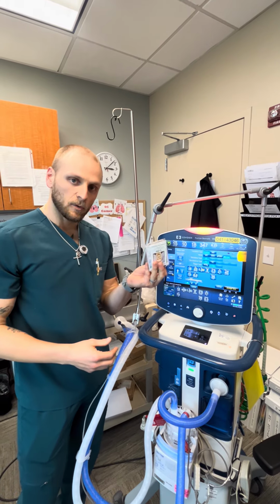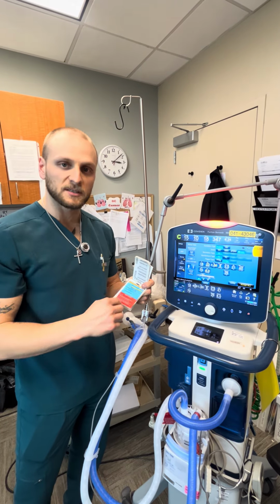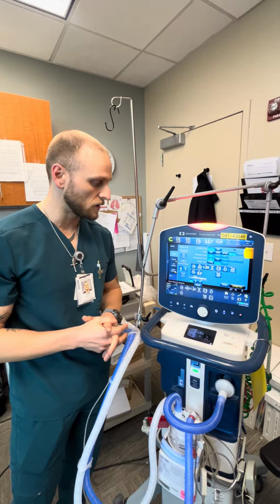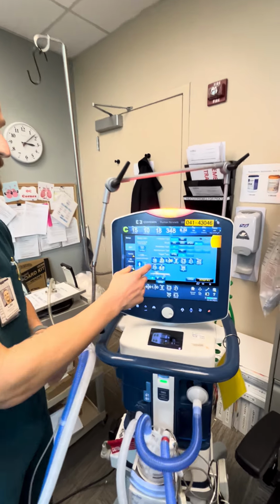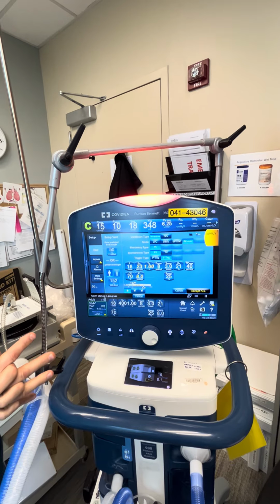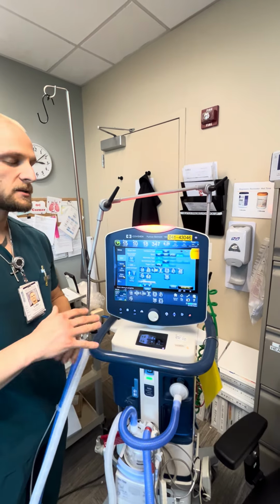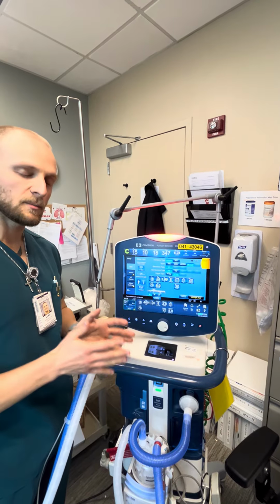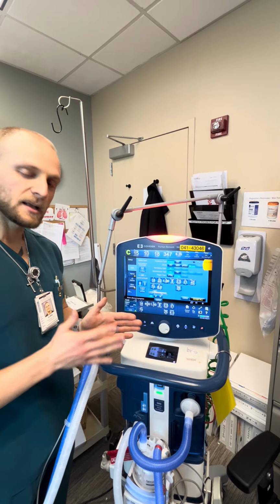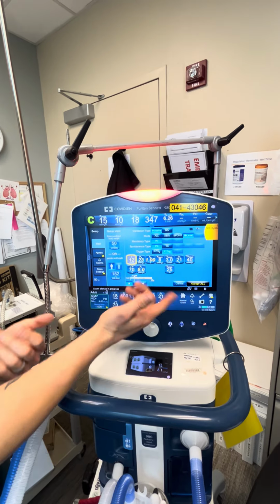So everybody, Renata came up with these badge buddies. I'm going to go through it here, but you can see this will be step-by-step through your badge buddy as well, all right? So going to the frequency, anywhere from 10 to 15 is going to be where we start. A couple questions I always get is, Luke, what if the patient's on a frequency of 20, 22, 23? Does not matter. We're going to start our patients in bilevel mode between 10 and 15. So we'll come here, we'll put them on 12 as a happy medium, okay?